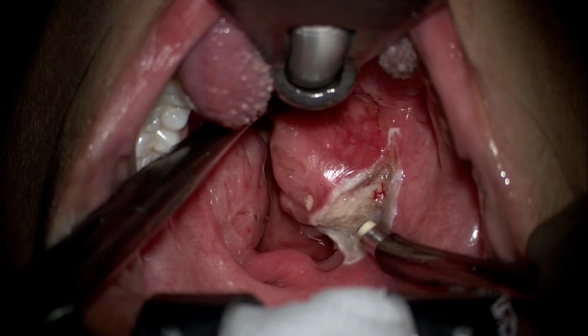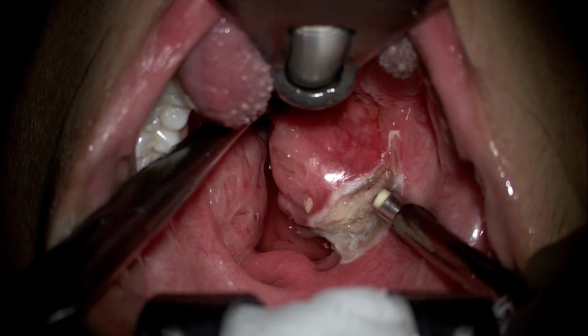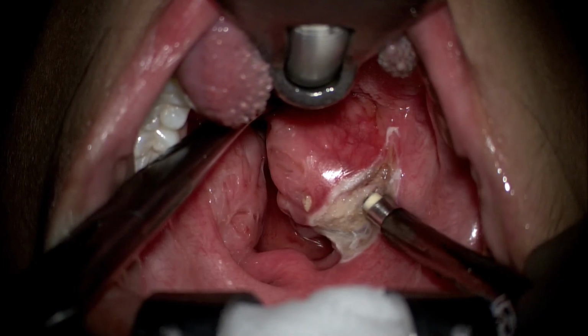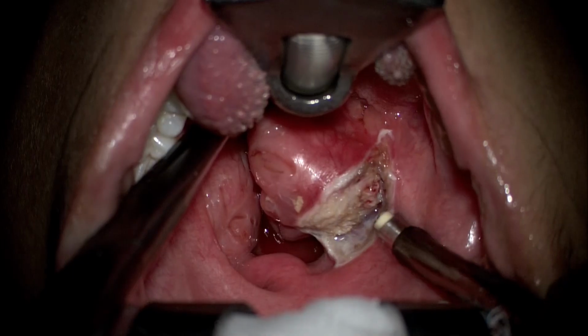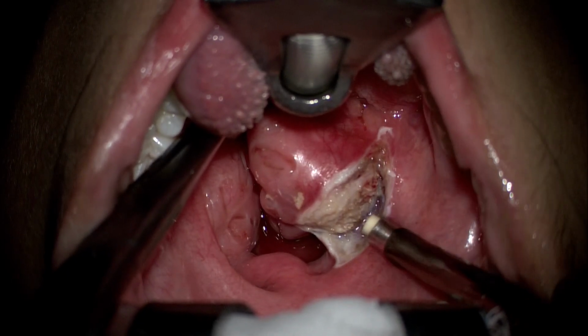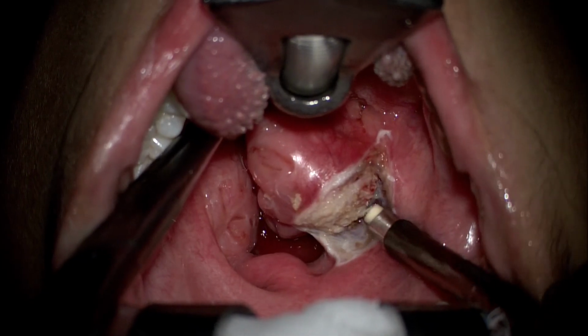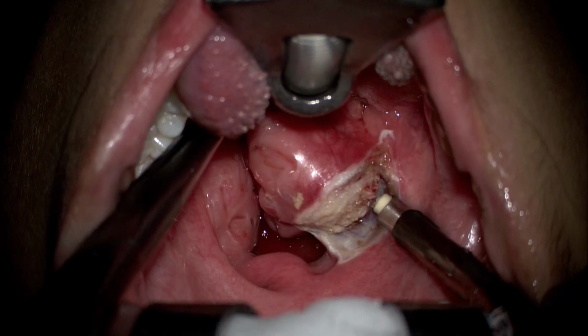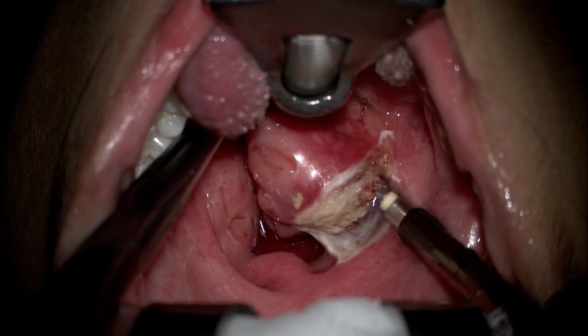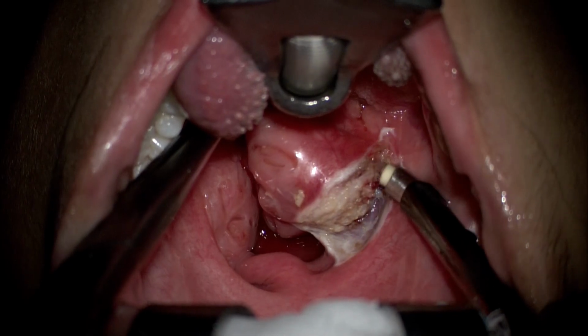As we keep dissecting using the coblation device, we keep exerting a medial pull on the tonsil with a Dennis Brown tonsil holding forceps. As you see here, sometimes a slight bleeding can be encountered with small vessels being exposed, and once that is seen, they can be safely coagulated using the coagulation mode of the coblation device before resorting to further dissection.